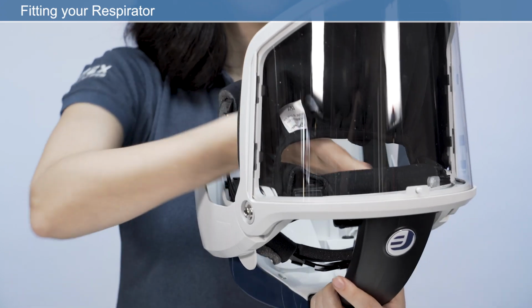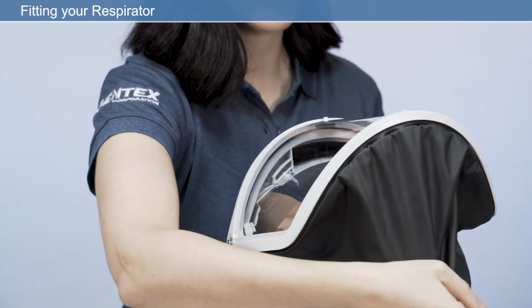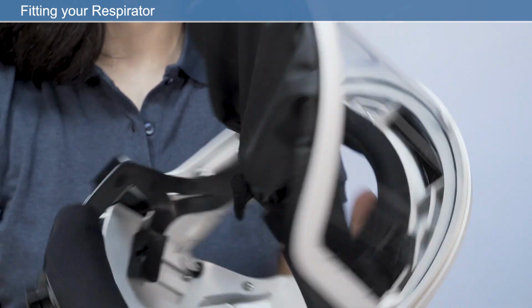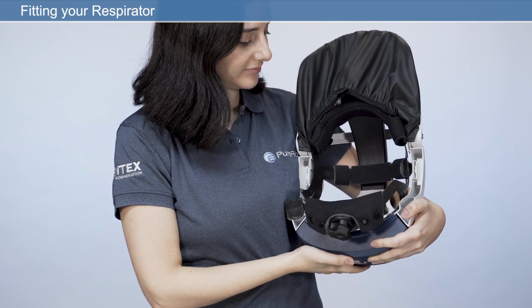Before using your respirator, check that the face seal is inserted into the face shield correctly. For general use, the face seal should always be checked for damage and replaced if required. For maximum comfort, it's important to take time to ensure your respirator fits correctly before use.